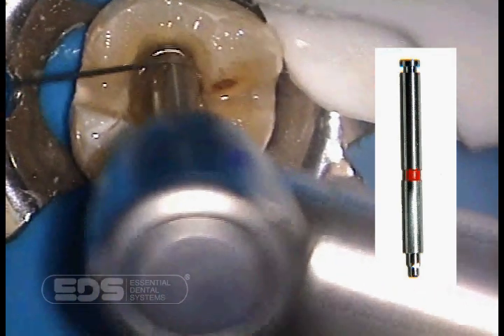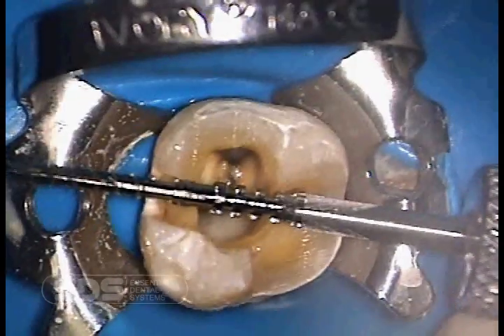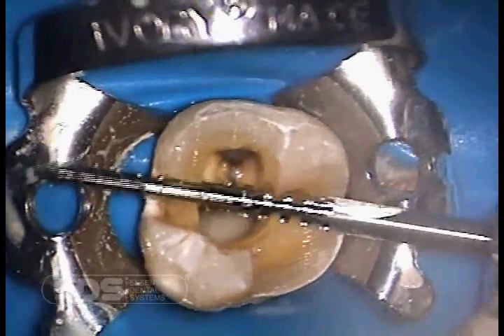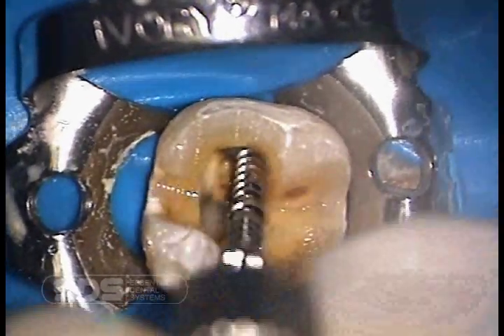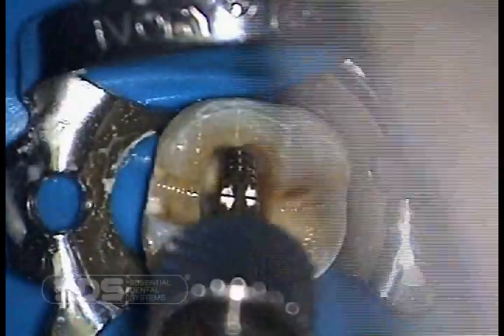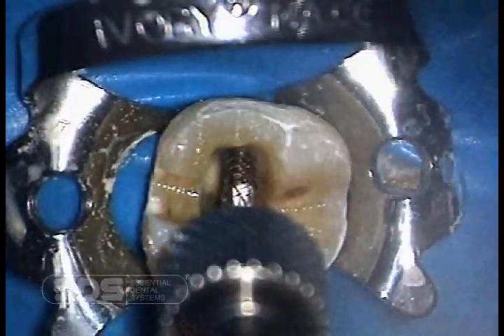At this point we will trial seat the Flexi Post to determine how it fits in the canal. When using the Flexi Post, always make sure to insert the post to its full length first. If you find the post is too long and the second tier does not fit within the preparation, remove the post and shorten from the apical end. By inserting the post first, one has the full length of the split shank to make sure the threads create a thread line inside the root atraumatically.